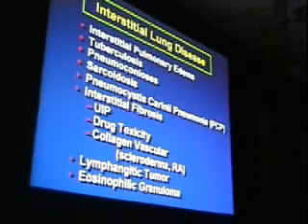So, in summary, I want you to keep in mind this particular differential if you encounter a case of interstitial lung disease, reticular, nodular, small nodular. Think first of interstitial pulmonary edema. Then TB and the pneumoconiosis if it has an upper lobe predominance. Sarcoid and PCP if it's diffused throughout the lungs, interstitial fibrosis for all these categories, and lymphangitic tumor if it's lower lung, and if it's none of the above, think eosinophilic granuloma.